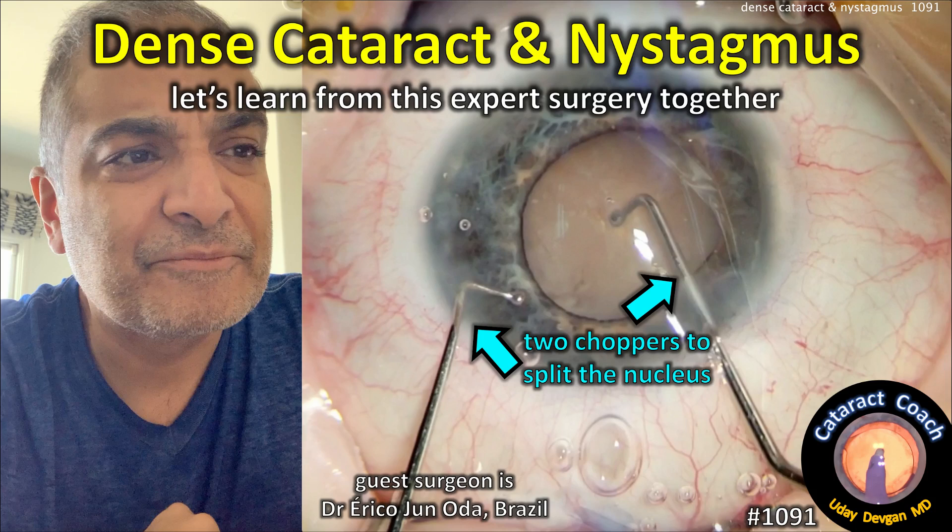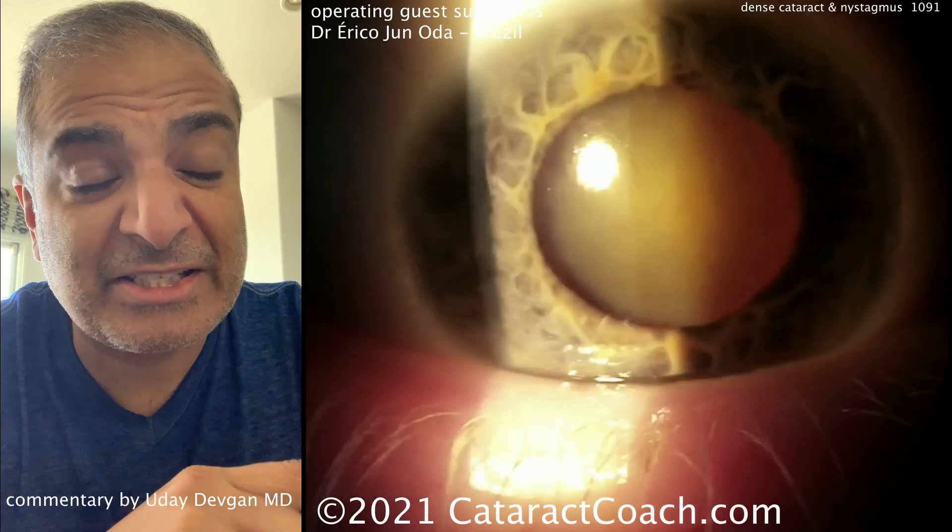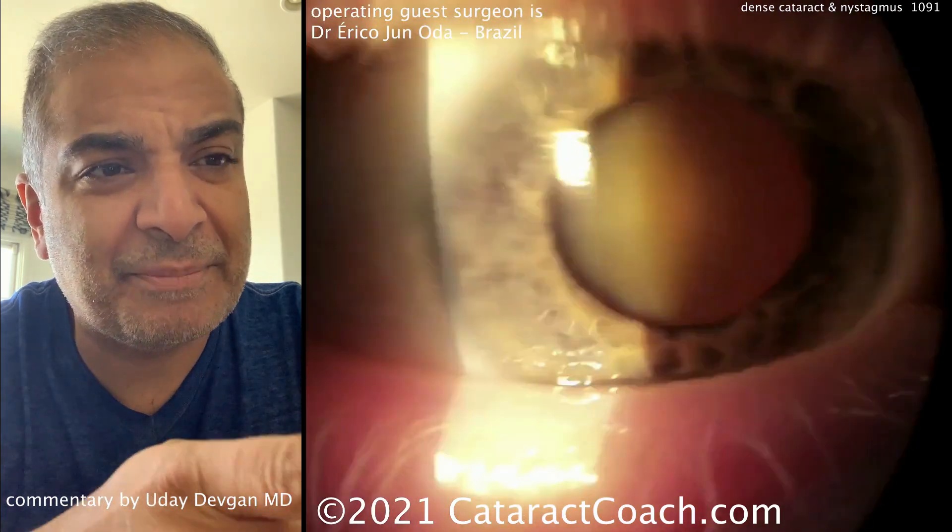CataractCoach.com. We've got a special case here today from Dr. Eric Ojun Oda from Brazil. It's a patient with nystagmus, dense cataracts, and ocular albinism. Here's the pre-op exam.